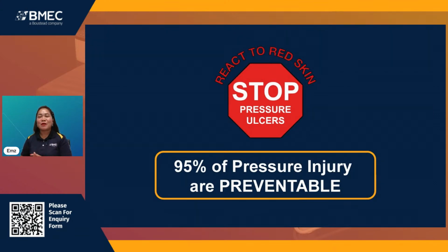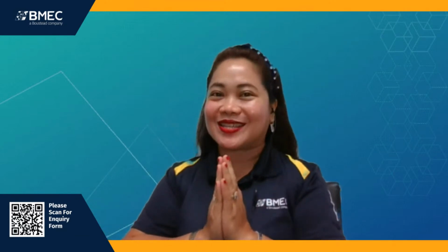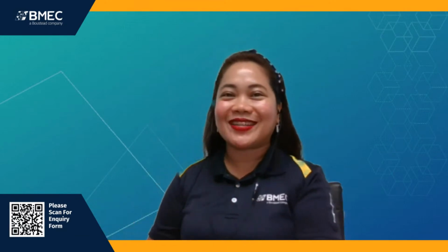As you can see, 95% of pressure injury can be preventable. When you see redness, stop. So we should assess and think about it, and also know that it is the start of the pressure ulcer. Okay, I'm excited because the second part will be the demo by Alvin of our Toto Curocell alternating mattress, which will help our nurses and patients. Let's go, Alvin!